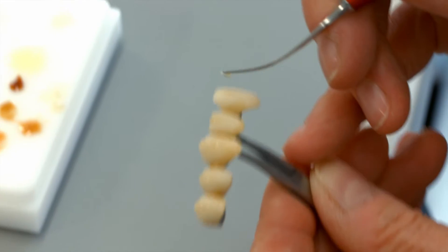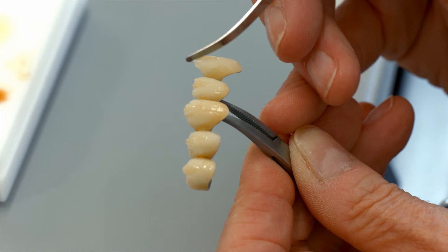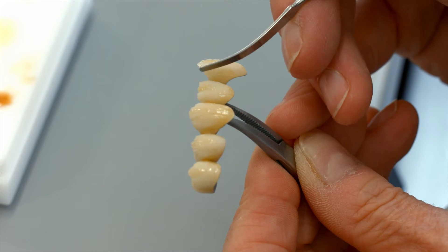You can add further characteristics in the interior areas by applying opalescent incisal or shaded transpa materials. Check all the characterizations against the matrix.